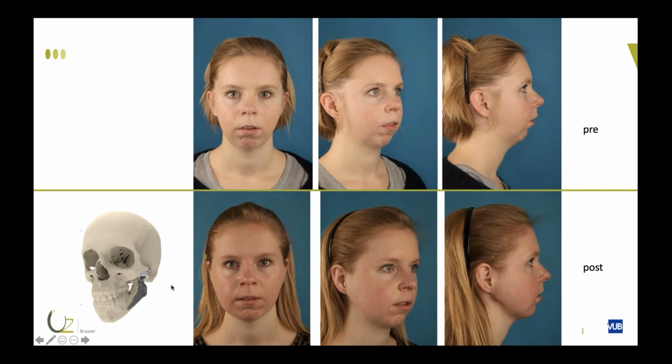I think microlipofilling or a frank gluteal fat graft could be of help here, but she was happy. No pain at all. After 1 month, the visual analog scale dropped to 0, and she could resume normal life.